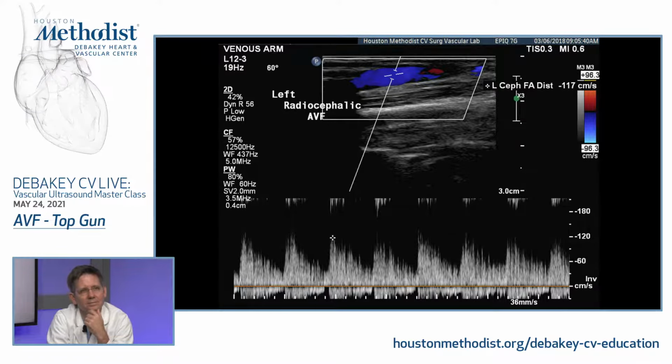And do you have any secrets about when your velocity drops by half? Do you have any diagnostic value? Some of my sonographers like to call it a 50% stenosis based on that flow drop, not just when you have a velocity increase, but when you have a velocity drop. Well, you have to have them study that, because that's not the convention, right? The convention is really to look at the spike in the systolic velocity, not the drop afterwards. But it's intuitive that it plays a role. I don't know that anybody's actually looked at that carefully.